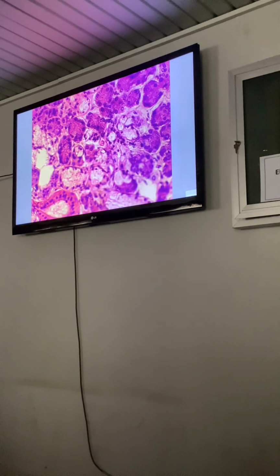In this gland, the secretory portion consists of serous cells. Serous is predominant in this gland. In addition to serous acini, we can see mucus tubules. Mucus cells are arranged in tubules. This structure is called the mucus tubule. Each tubule consists of mucus cells.